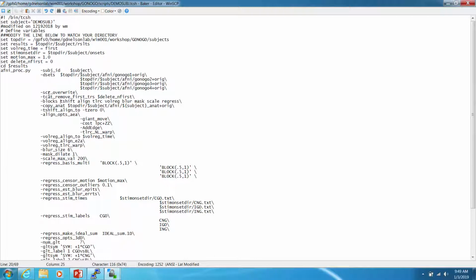There is not a strong consensus about which order to run things in, and it affects what happens to your data. So it's important for publication purposes that we are super clear on all of the pre-processing steps we did and what order it is if we want anybody to replicate our results. It's a broader problem in neuroimaging, but it's important to know these steps and how we do them. And each of those are detailed in that page, right? Yes, each of these steps are detailed in the page. I'm going to quickly summarize them because it's pretty long anyway.